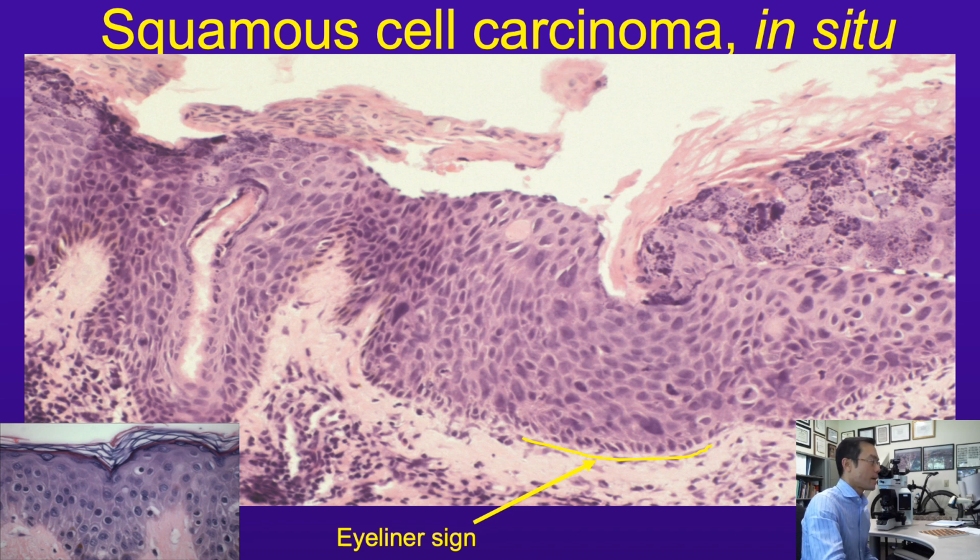The way that it makes sense to me, based on histomorphology, is that I think about squamous cell carcinoma in situ, or Bowen's disease, as a neoplastic transformation of a spinous layer keratinocyte, whereas in contrast, I think about actinic keratosis as a neoplastic transformation of a basal layer keratinocyte. And when I think of it that way, the way that it appears in the tissue sections makes sense to me. Admittedly, however, I do not have any supporting scientific citations to offer for that. All I can say is that it's gotten me through practice thus far.